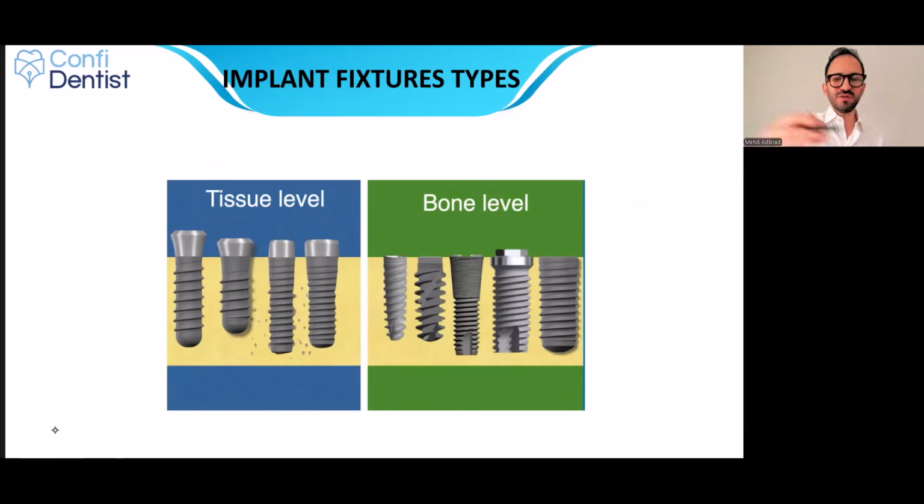And I will show you some examples that help you to better identify the implant types. But 70 to 80% of the implants in the market are bone level. Right now, the bone level implants are much, much more popular because of their superior performance in the aesthetic zone.